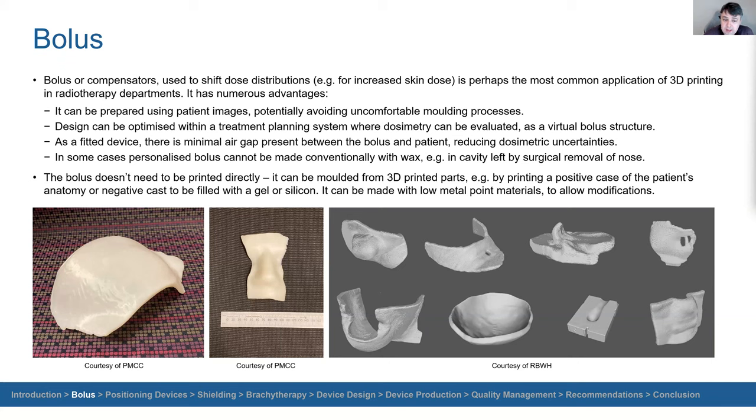As a fitted device, it can often match the patient really well. You can minimize the sort of air gap that might be there for maybe sheet bolus or jelly bolus, which can reduce dosimetric uncertainties, particularly for irregularly shaped fields. So long, skinny fields, for example. I mean, in some cases, personalized bolus really solves a problem that can't be solved very easily with conventional techniques like wax. And I'll show a picture of one of those at the end of the presentation.